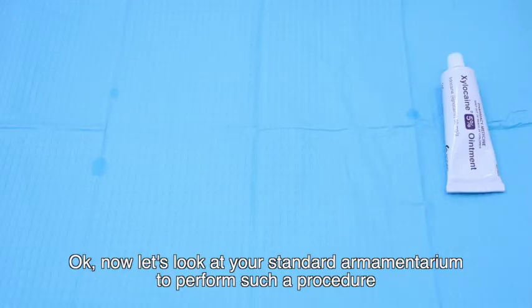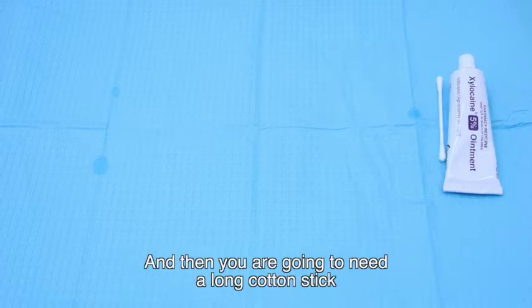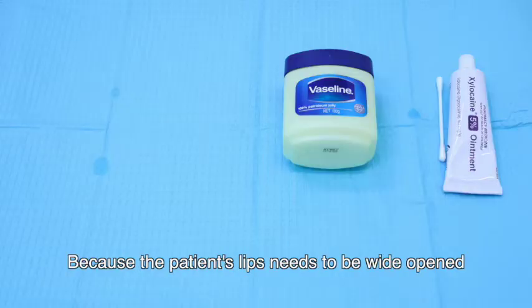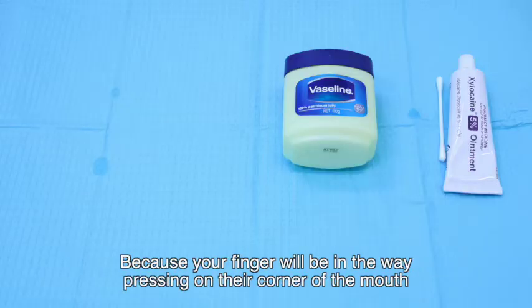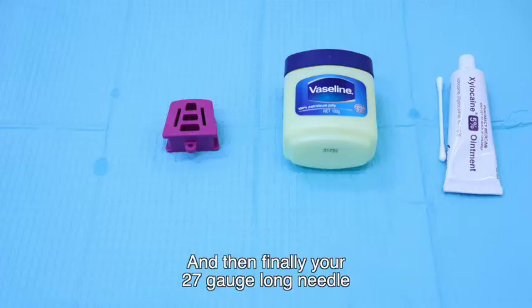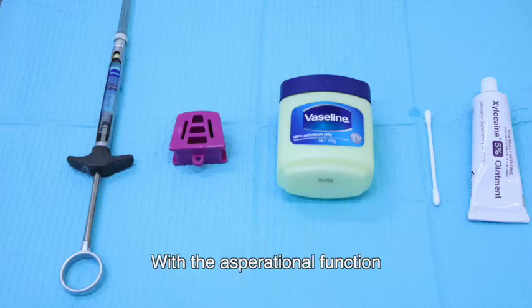Okay, now let's look at your standard armamentarium to perform such a procedure. First, you have your good old-fashioned topical ointment, and then you're going to need a long cotton stick, the good old-fashioned Vaseline, because the patient's lips need to be wide open since your finger will be in the way, pressing on the corner of the mouth, and then a mouth prop, and then finally your good old-fashioned 27 gauge long needle with the aspirating function.